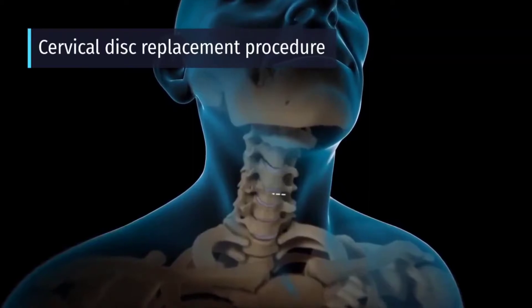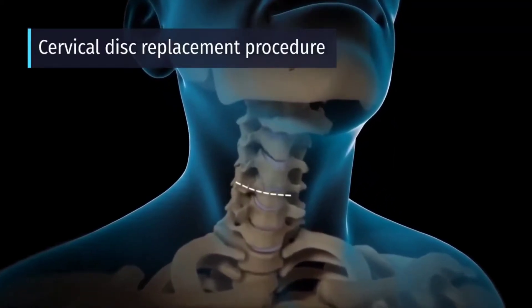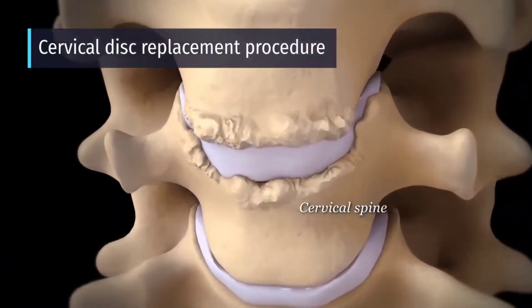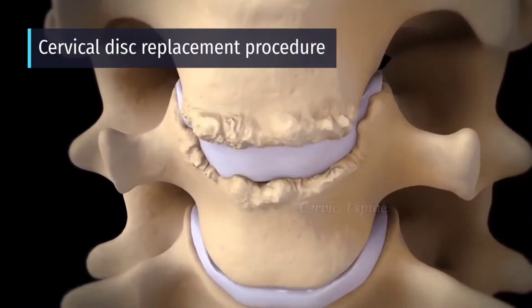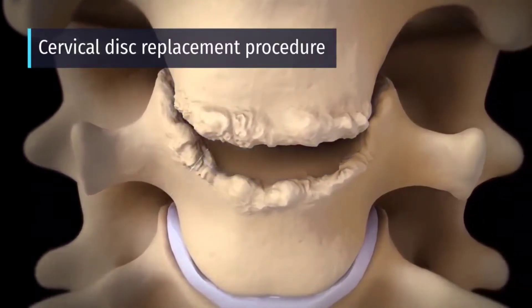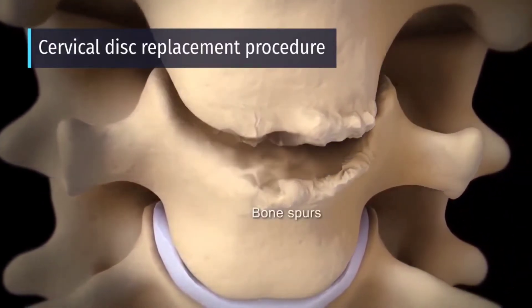Your surgeon will make an incision on your neck. The part of your cervical spine containing the damaged disc will be exposed. Your surgeon will remove the entire damaged disc, then remove any bone spurs.